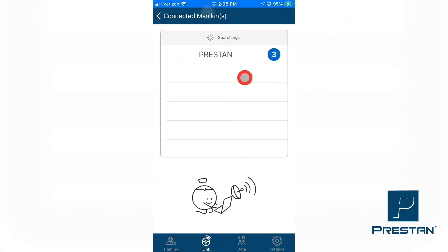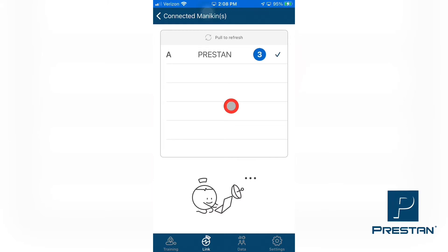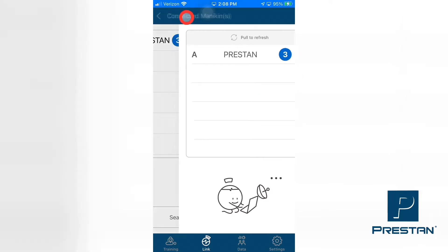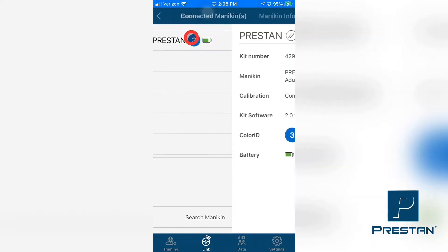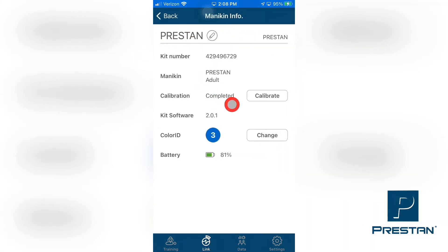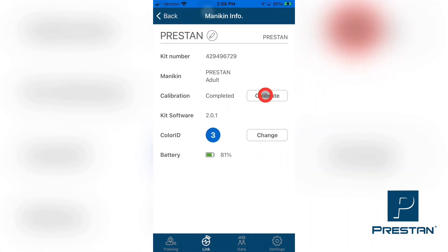A list of connected mannequins will appear. Select the desired mannequin from the list. Ensure that a checkmark appears next to the name of the selected mannequin. Select connected mannequins, and then select the chosen mannequin from the list. Tap Calibrate in the row titled Calibration.